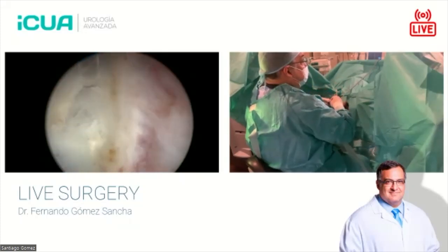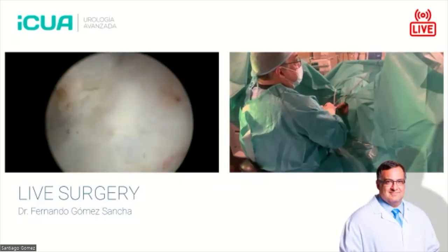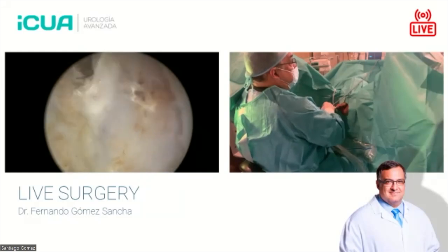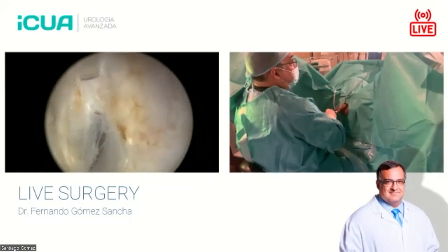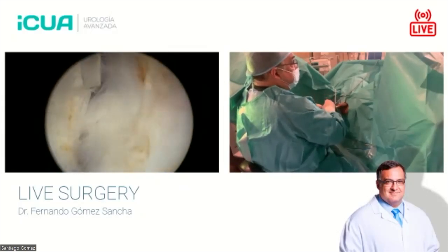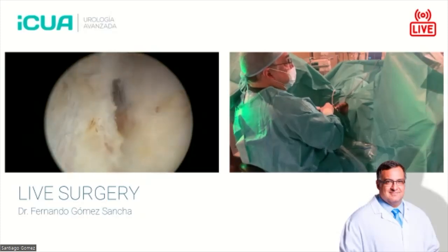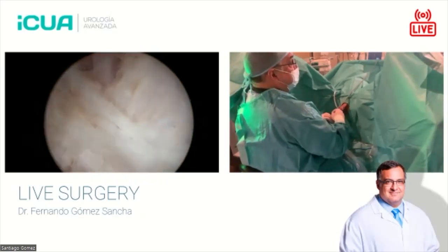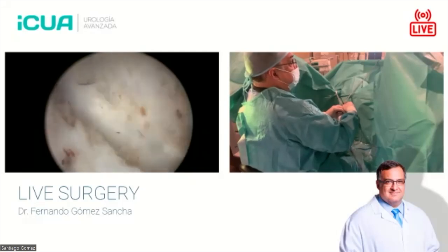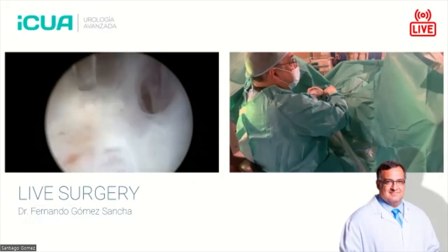So basically, when this energy comes out of the fiber, it's going to find the water. As it has affinity for water, it's going to heat it very fast. So close to the fiber, there will be a sudden deposition of energy that will cause a very abrupt increase in temperature in the water, to the point that we might have super hot water, over 100 degrees. And then, of course, this water has to transition very fast to vapor, and that generates this bubble that we see on the videos from companies. And you can picture this bubble like an explosion.